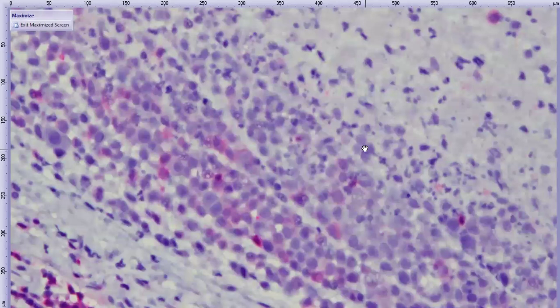So essentially with malignant cells, we can see cytoplasmic expression. The shuttling of the CD3 to the surface of the cell is not as effective anymore, so you can get some cytoplasmic expression. I would also add that our red chromogen can be a little bit more hazy than the brown chromogen, but it's nicer in your ocular tissues because there's often so much melanin sprinkled about in the eyes. I would say that there are probably some cells that are a little bit more membranous or perimembranous, and many that are quite cytoplasmic.